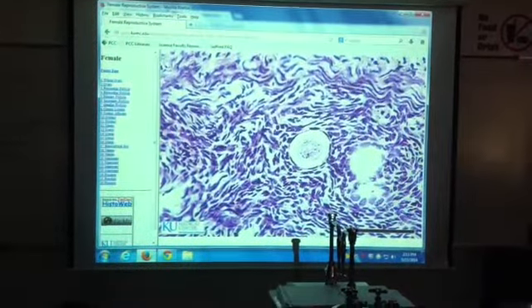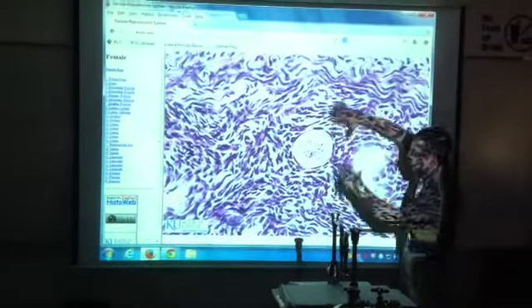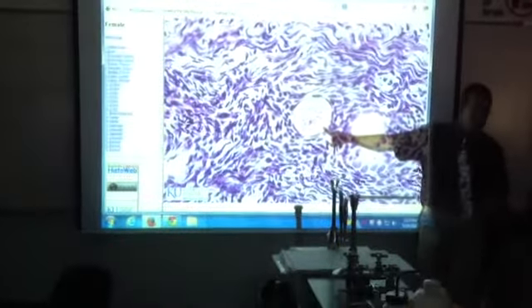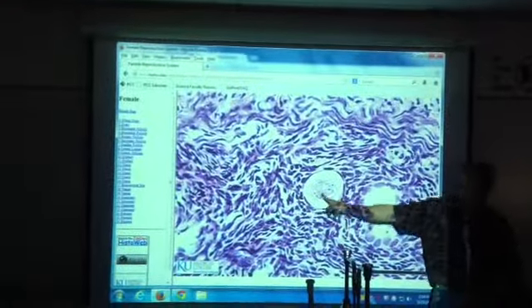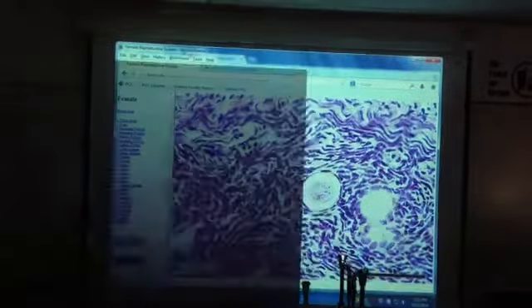So we're zooming in closely on an ovary. Here's a little, this would be really, really tiny, with not much structure. So that follicle is primordial. That egg is, yay. Too easy, drill sergeant.